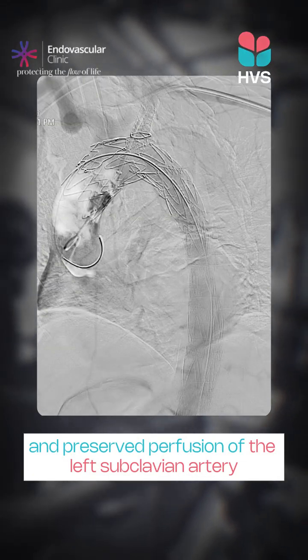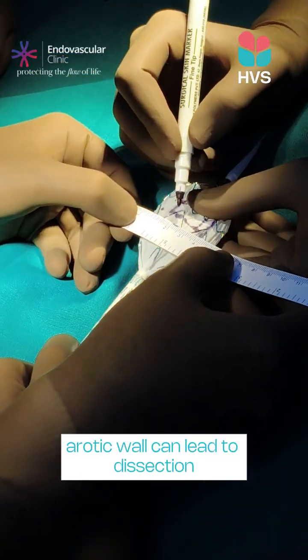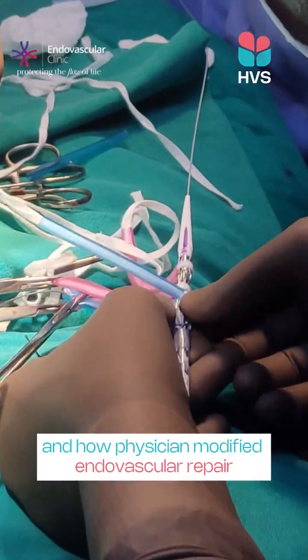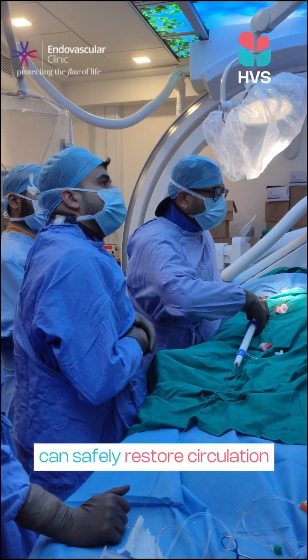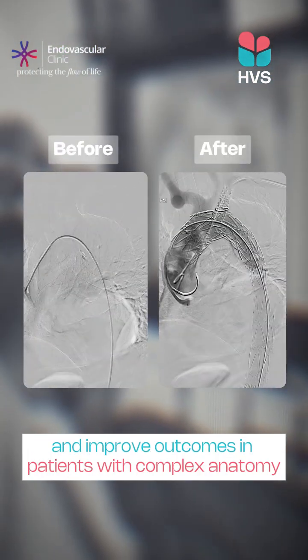the left subclavian artery. This case highlights how a weakened aortic wall can lead to dissection and how physician-modified endovascular repair can safely restore circulation, protect vital vessels, and improve outcomes in patients with complex anatomy.